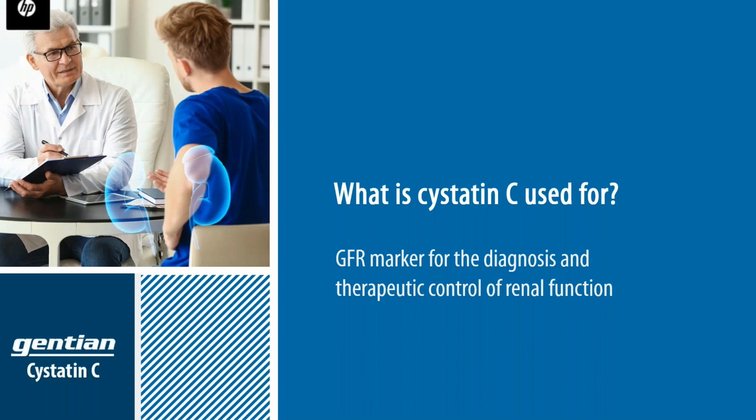What is Cystatin C used for? Cystatin C is a way to estimate the GFR, and this is used to diagnose and to have therapeutic control of renal function.